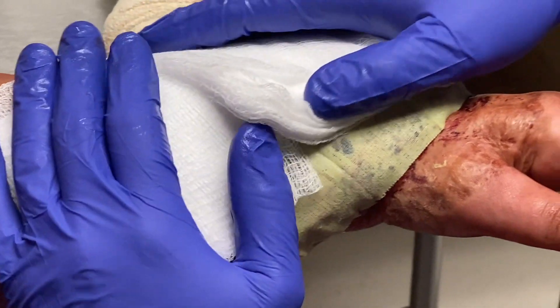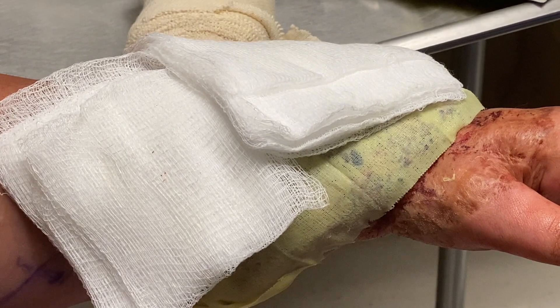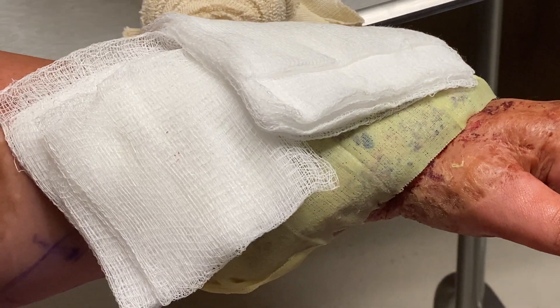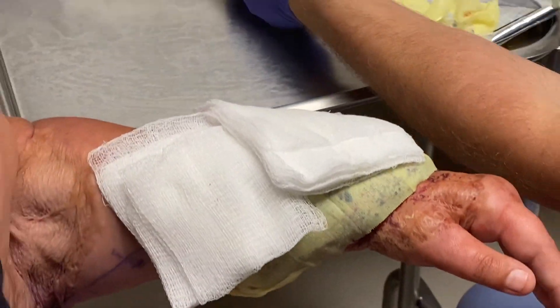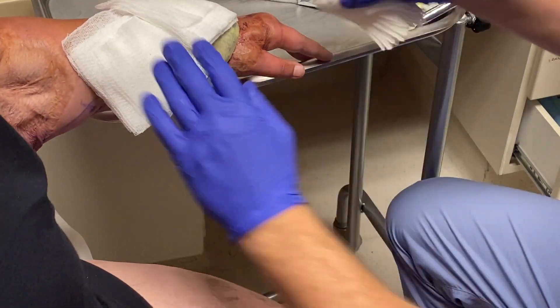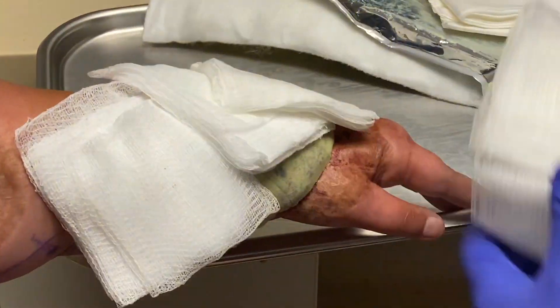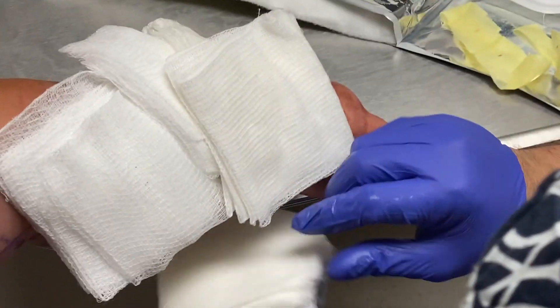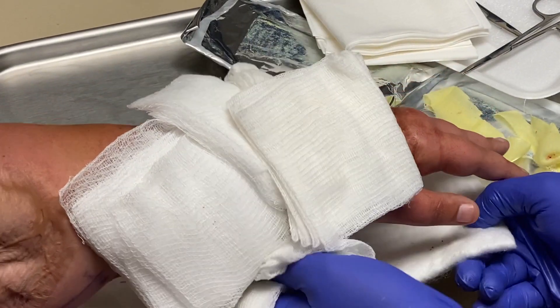We're going to make sure we pad this appropriately — a good bulky dressing over the top, with four-by-four gauze over the top and along the side. To make this easier on you, the splint we're going to use I'll hold in place temporarily to keep everything in position.